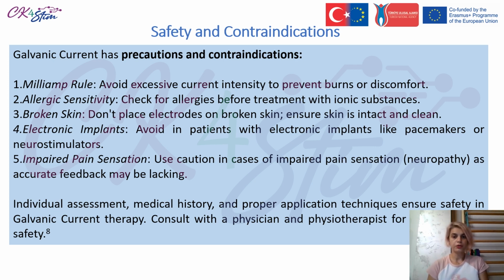Therefore, to adhere to all of these rules, we should definitely have an individual assessment of the patient with the medical history and proper application techniques that will ensure safety in galvanic current therapy. Consulting with a physician and a physiotherapist for a suitable treatment and safety measures is for sure implied.